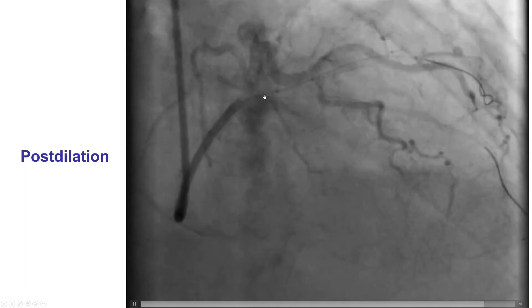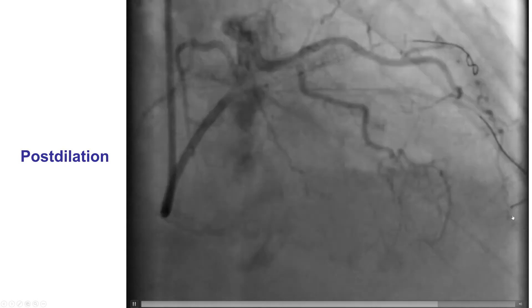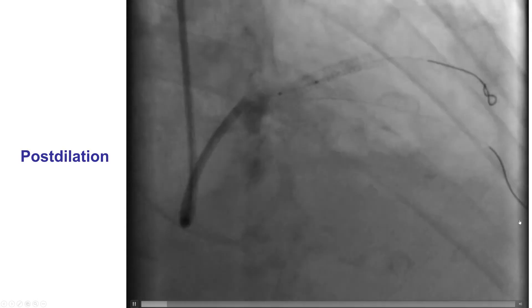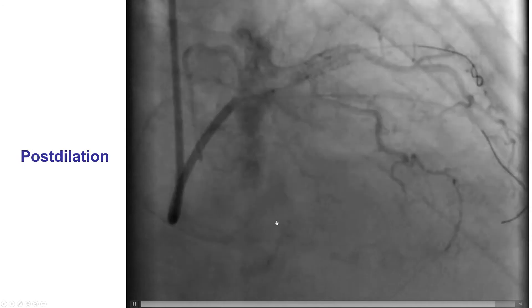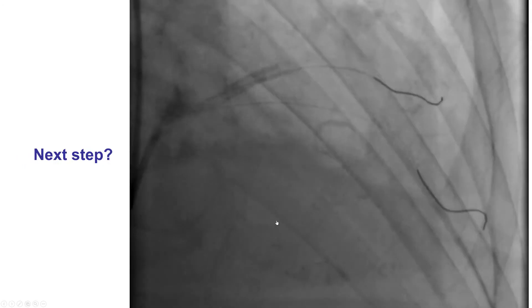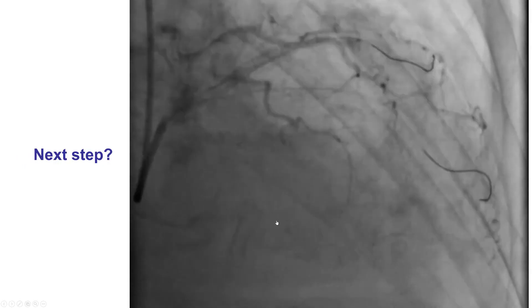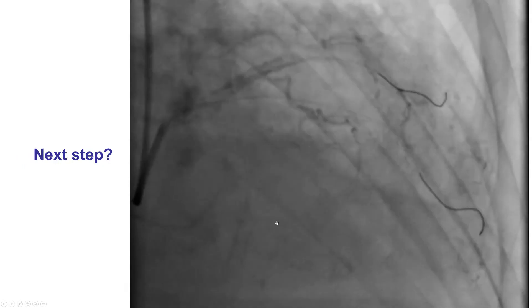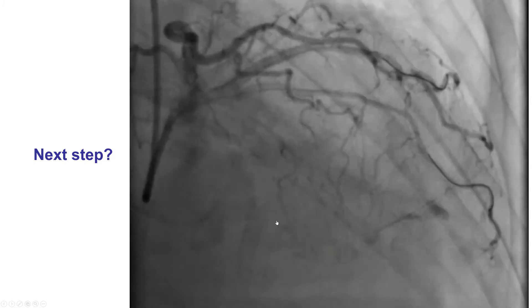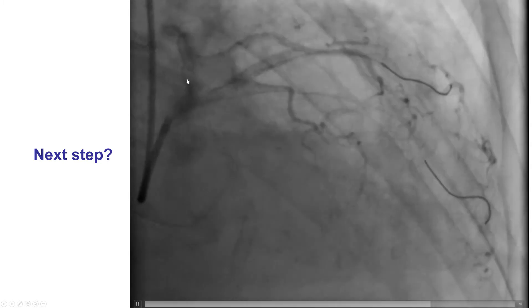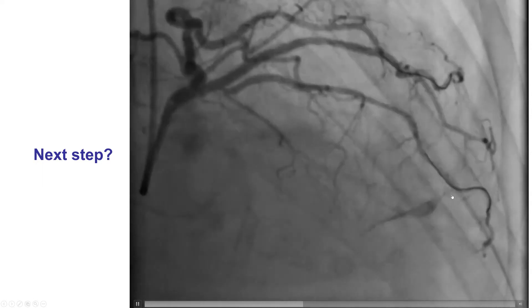Moving on, there was post-dilation of that part of the vessel, we placed a stent, and there was still this extravasation. This was not fully appreciated until after the stenting of the diagonal branch was completed with a nice result. Then we repositioned the wire.